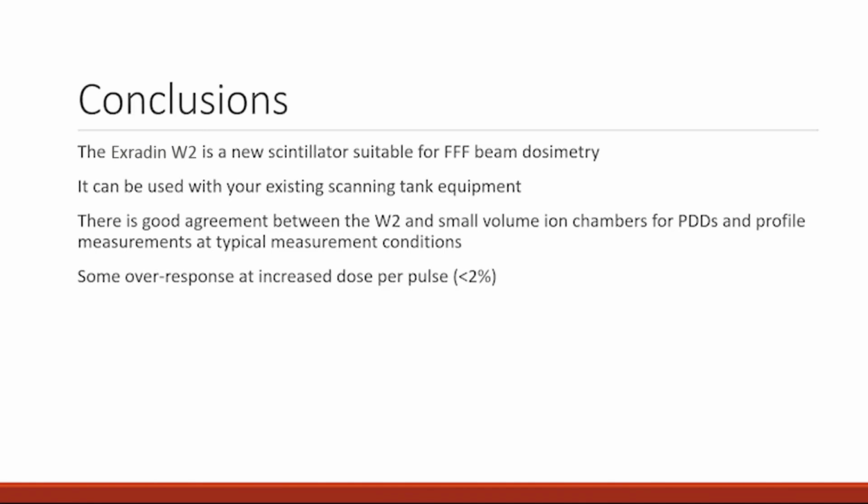And so even with just scanning and not doing step by step, you're probably at a loss for your benefit and time ratio for very large fields, but anything under 10 by 10, to get those accurate small fields, is definitely worth it. Yeah.